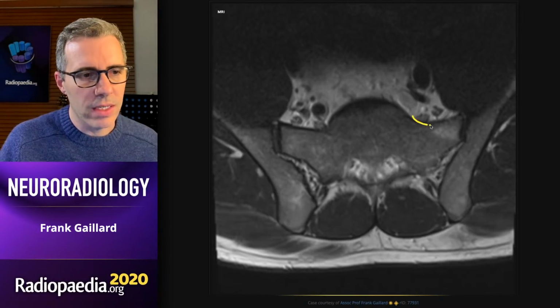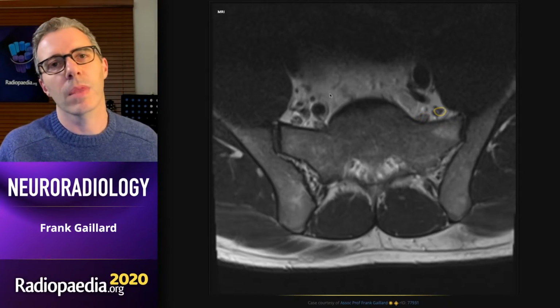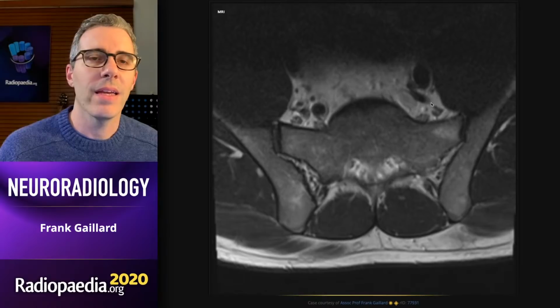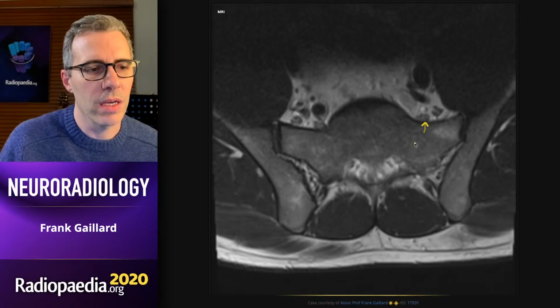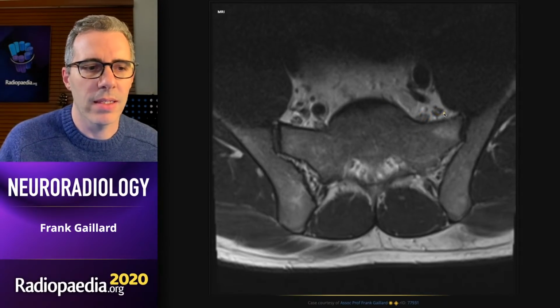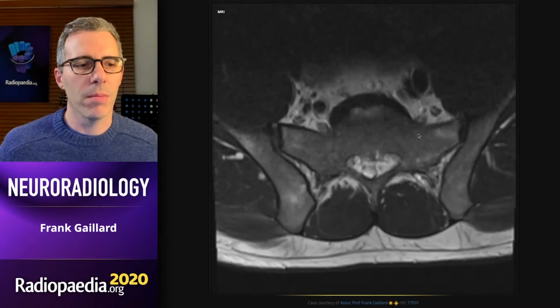This is a pretty easy to identify landmark, sacral ala, and then you'll have nerve roots sitting in front of it. The L5 and the S1 nerve roots are about the same size, whereas the L4 nerve root is much, much smaller. So if this was the L5, then we'd expect the L4, often 2 little nerve bundles, much smaller than the L5. Whereas when you see 2 nerve roots side by side that are roughly the same size, that strongly indicates that that's L5 and that's S1. And then you can follow them up.